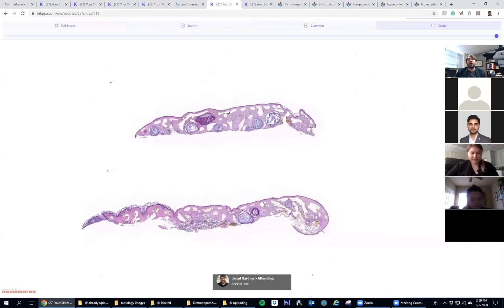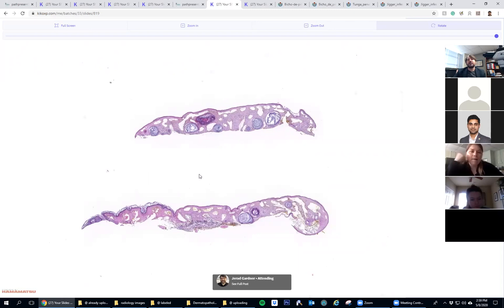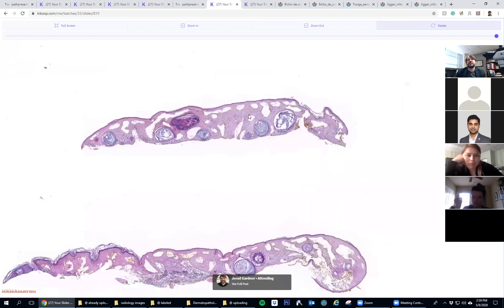All right, we'll do one more and then we'll call it an afternoon. This is just a quick little fun one. So this is a seborrheic keratosis - acanthosis, horn pseudocysts.